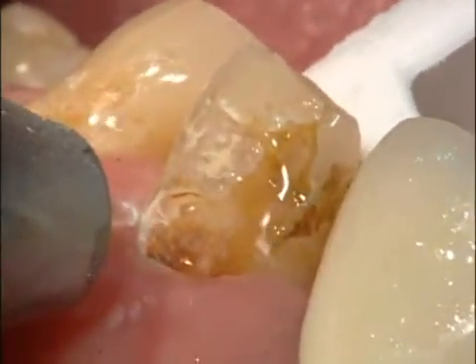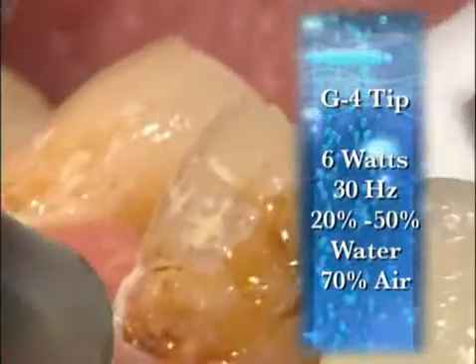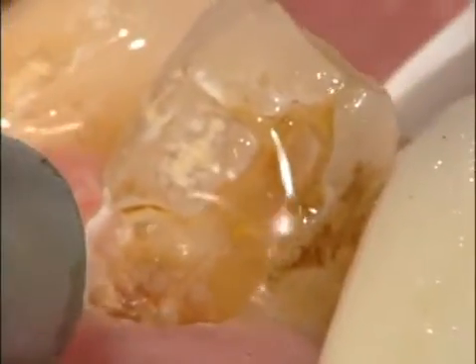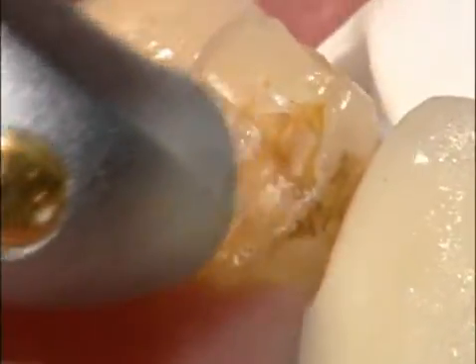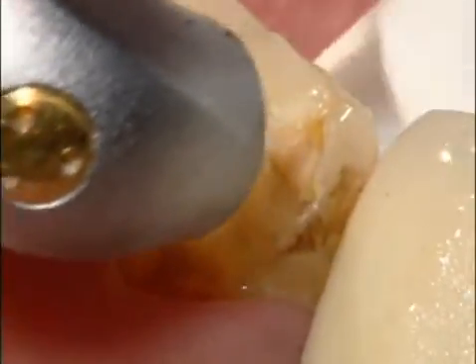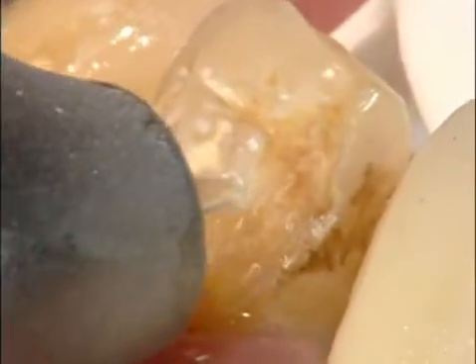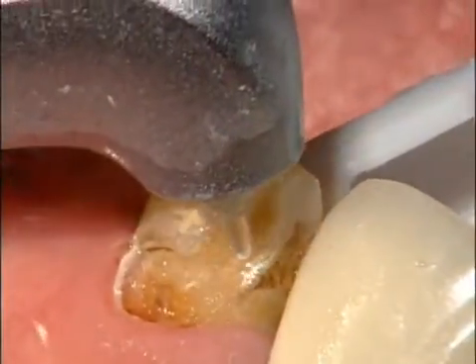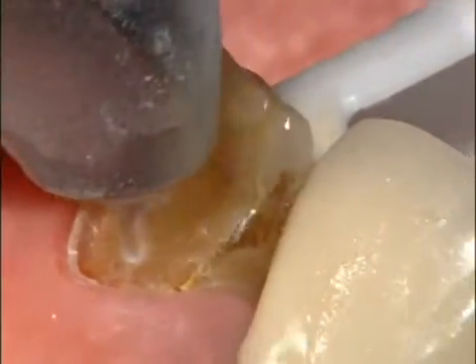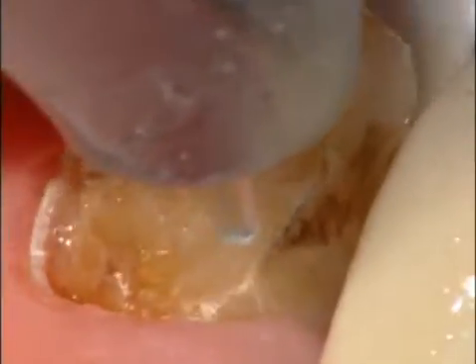I've done the anesthetic. We're operating with a G4 at 6 watts, 30 hertz, 20 to 50% water, and 70% air. You'll see there's a couple of spots in here where the laser turns the dentin brown. When that happens, and this is a case where high magnification when you're working is, I feel, very important. I do my surgery at 6x. If you see the dentin turning brown, that means you're too close, so you need to back off a little bit, or you don't have enough water. If you see the enamel turning white, then you're too far away. You need to get a little bit closer, and that'll clean up the etched appearance of the enamel.